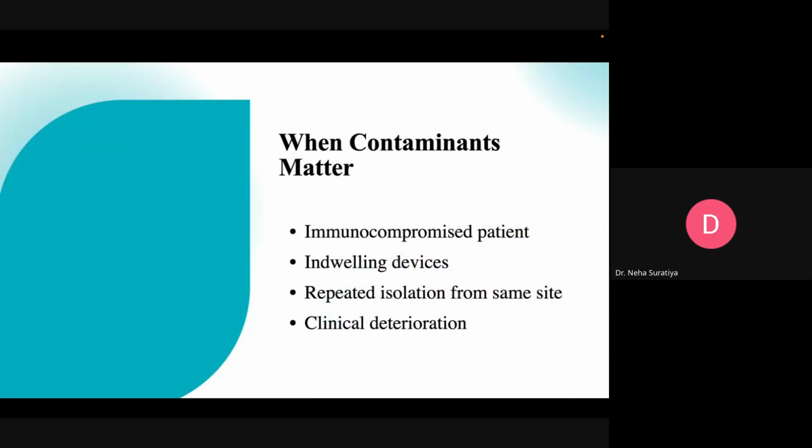And when do contaminants matter? कब ये चीज मैटर करती है? So now we come to a tricky part. Sometimes contaminants become real pathogens. Okay, now this is the very catchy thing, and you need to understand it, because it is also a bacteria in nature, right? They can turn into a pathogen, guys. Okay, sometimes, in very rare cases, contaminants become the real pathogen.